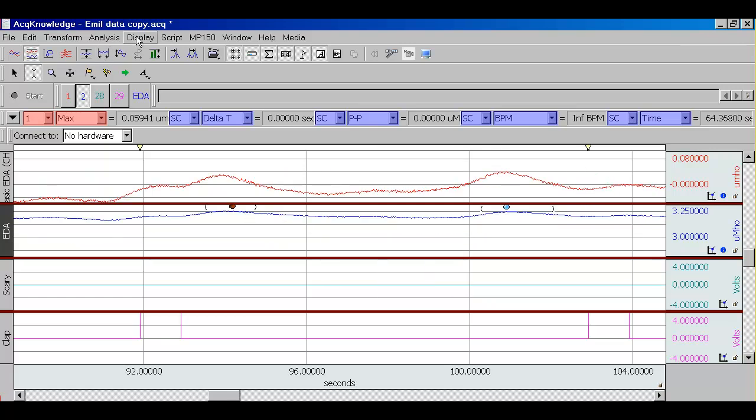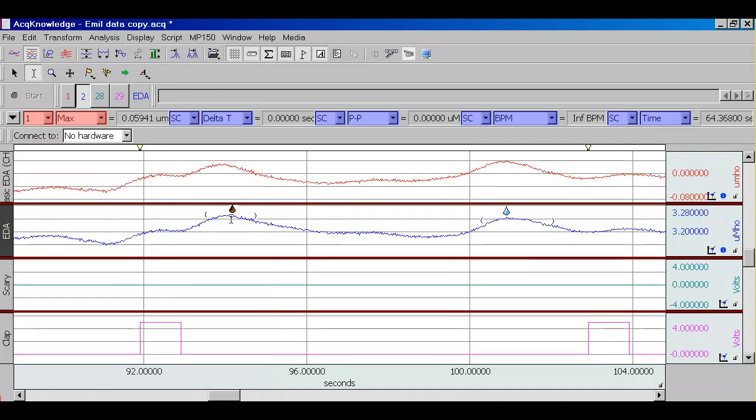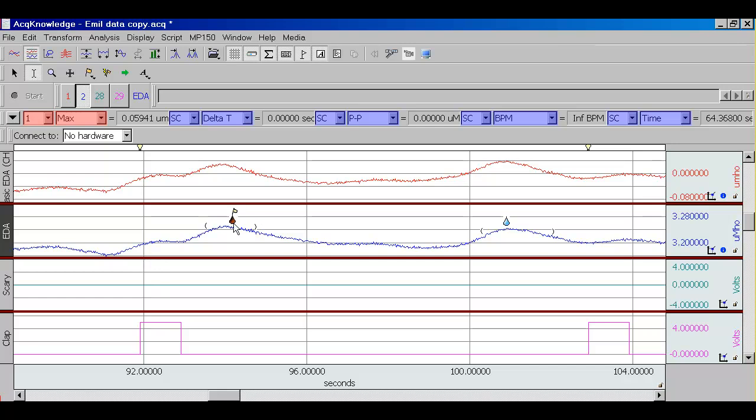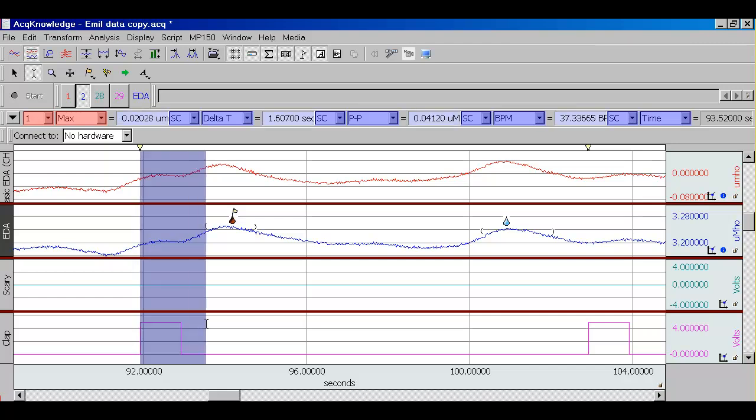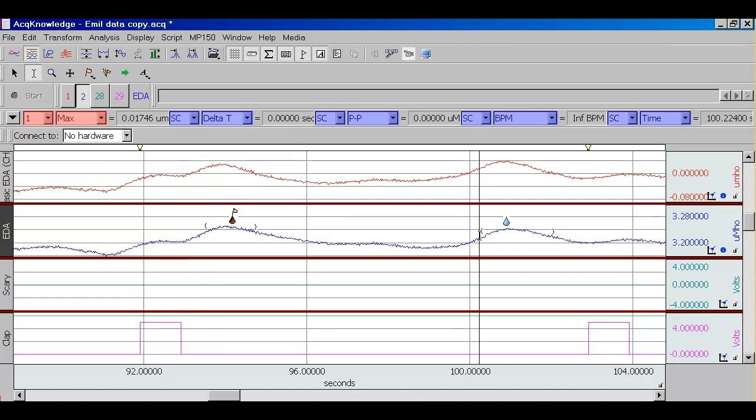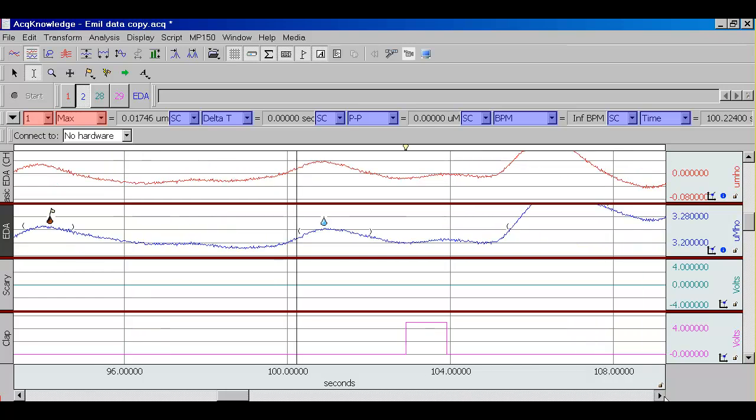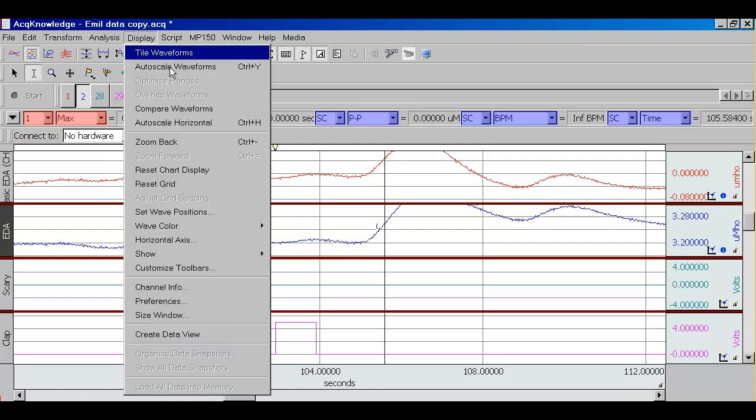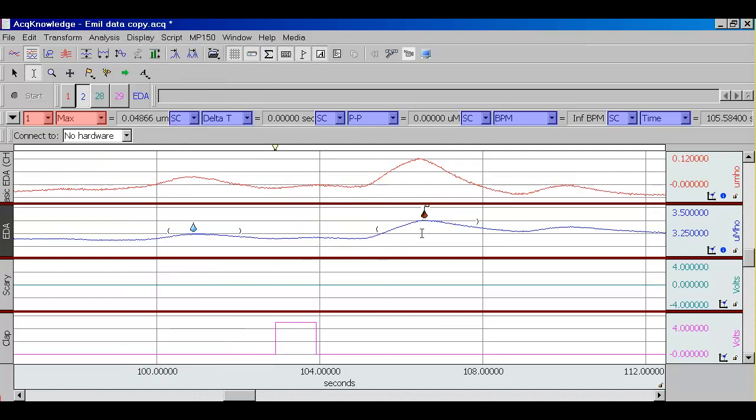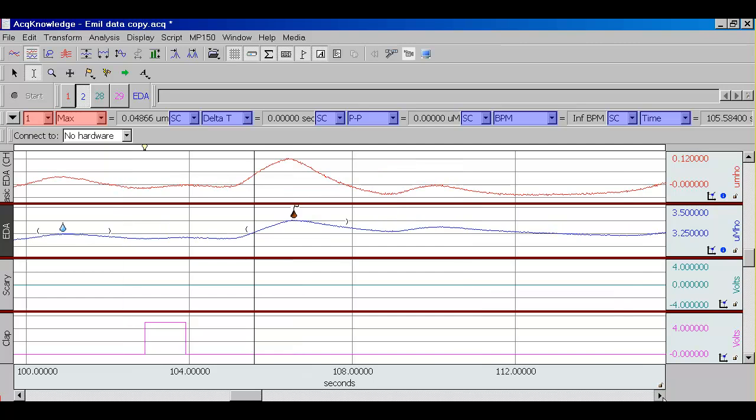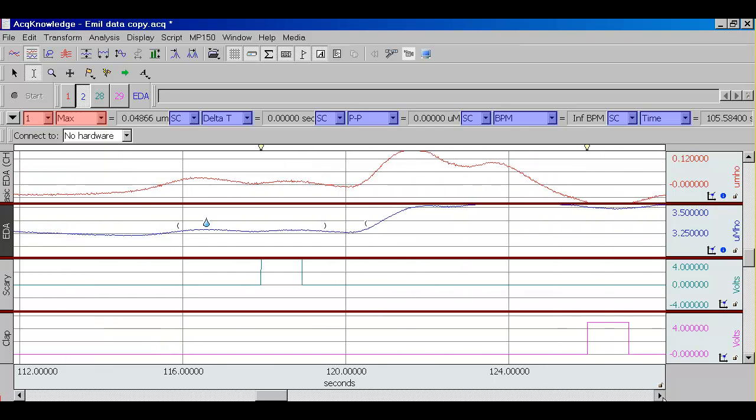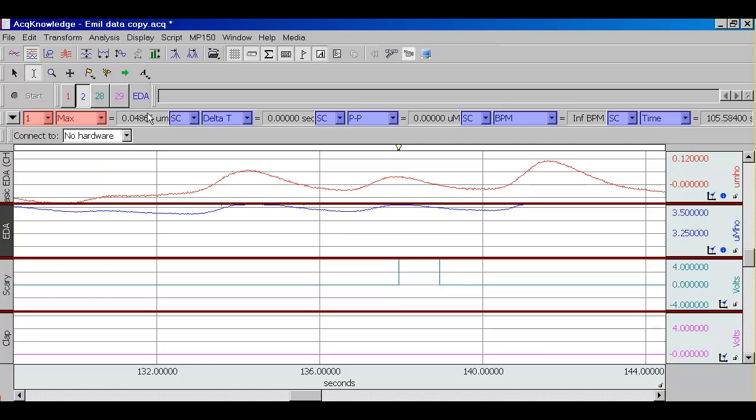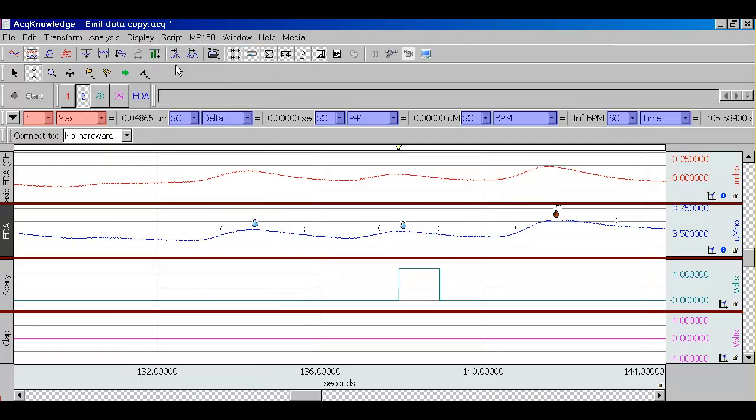If we scroll further, we can see an event that is marked as a specific skin conductance event. It has a little flag on the sweat drop, and it's also red. As you can see, it follows a stimulus presentation within the time period that we had specified in the settings. This one, for example, has occurred too late after a stimulation event. It is not considered a specific skin conductance event. This one here, on the other hand, is considered a specific skin conductance event. This one is happening just about the time of the delivery of the stimulus, and it is not considered a skin conductance event.